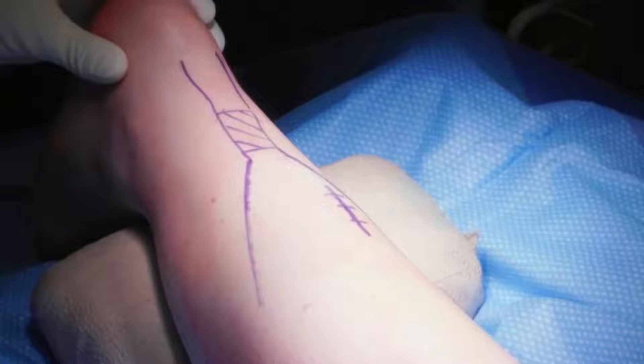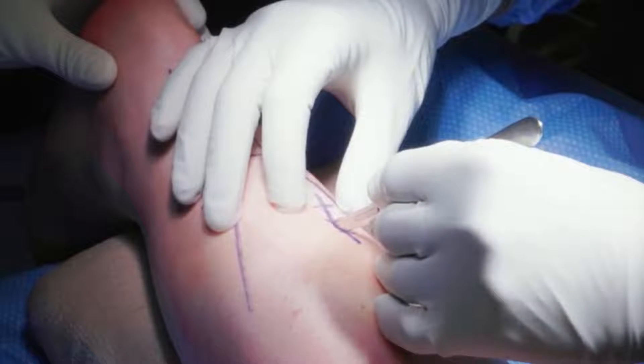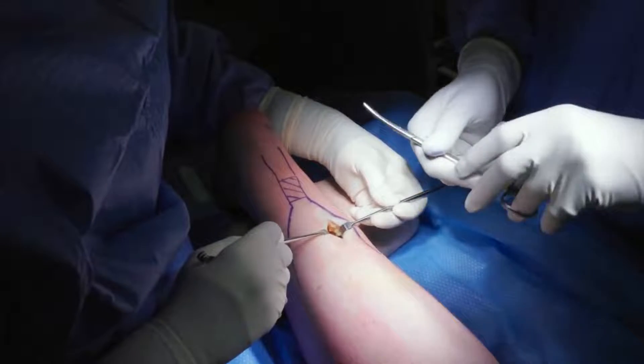A 3cm posteromedial incision is made with a scalpel approximately 5cm proximal to the rupture site. Dissection is carried out through the level of the crural fascia, ensuring to protect the sural nerve if it is visualized.